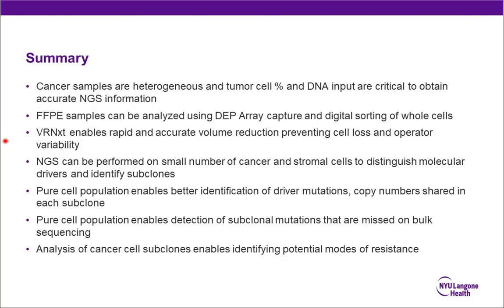So right now we are just looking into genetic and epigenetic markers of this specific population of patients that progressed. The reason why we went into DEPArray in the first place rather than just bulk sequencing is because these cores were obtained under a specific clinical trial, and they were extremely small, thin liver cores that we didn't think would be amenable to bulk sequencing. DEPArray proved to be a very good way to answer this question about two different populations of cancer cells that we didn't originally even think would be there.